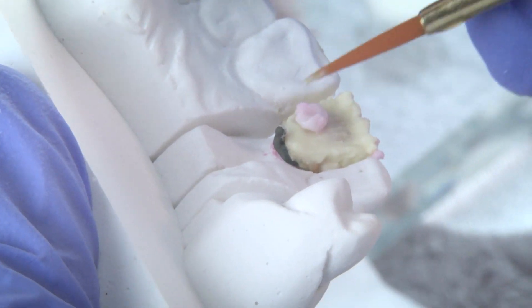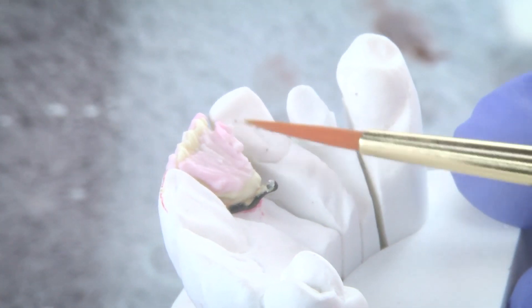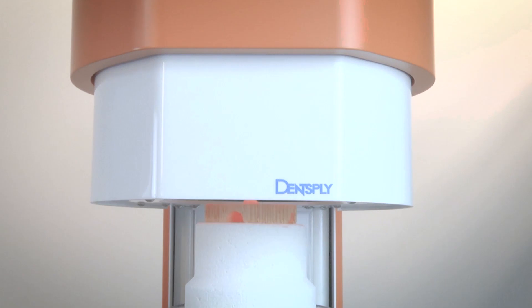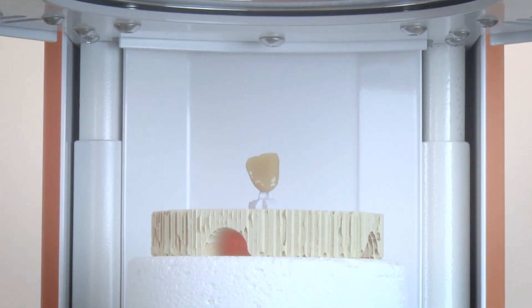Ceramico 3 produces a consistency of porcelain that's not only quick and easy to build up, but also helps control shrinkage. Organic colorants are incorporated in specific powders to help identify the placement of each layer during the buildup. Additionally, a standardized firing process helps every type of technician in your lab reduce remakes and increase productivity no matter their skill level.